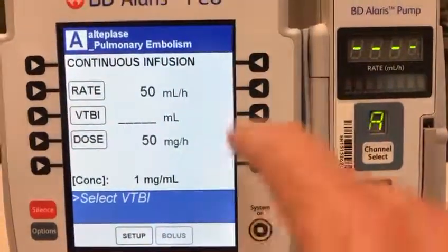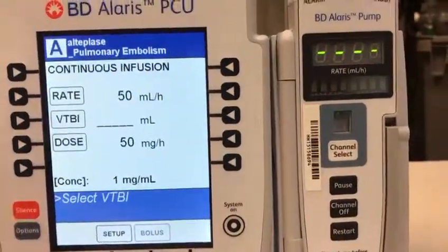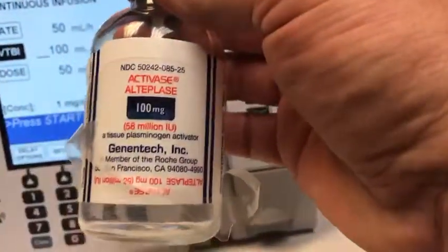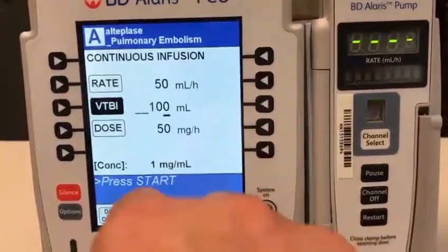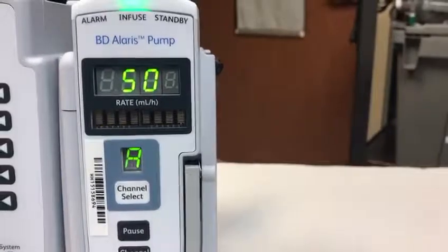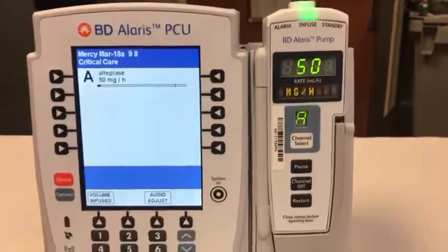So on this window, you can see that the rate is already pre-programmed at 50 mils an hour. That's going to deliver a dose of 50 milligrams an hour, and that's going to result in this infusion going over 2 hours to get the full 100 in. So the VTBI, the volume to be infused, is going to be 100 mils. And recall, that is the total volume in the alteplase or TPA vial. We're giving 50 milligrams per hour, which is 50 mils per hour, for a total volume of 100 mils in that vial. So we're going to come over here to start, and we look over here at the scrolling marquee, and you can see it says alteplase 50 milligrams per hour or 50 mil per hour infusion rate. This will be delivered over a 2-hour time frame.